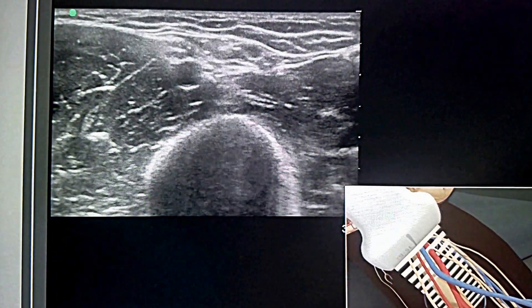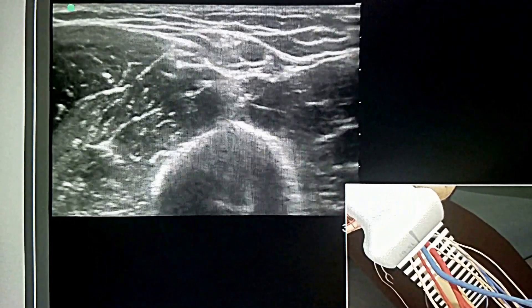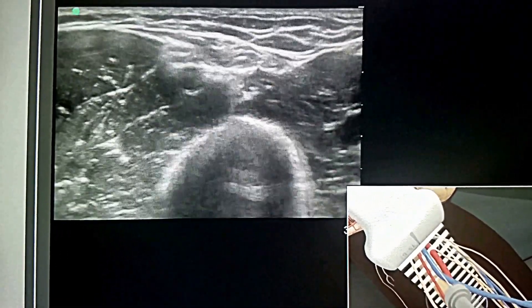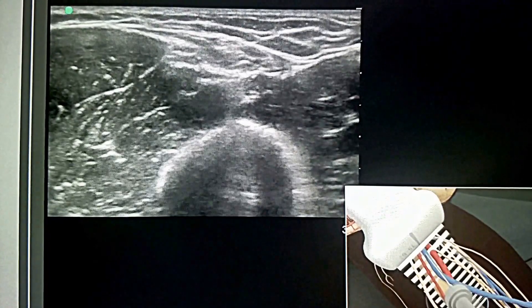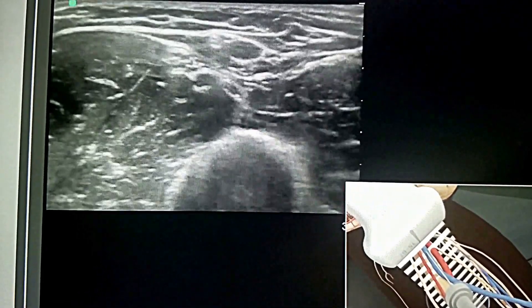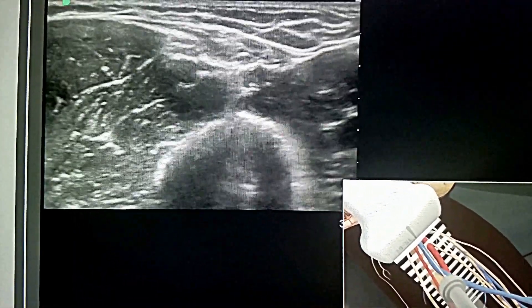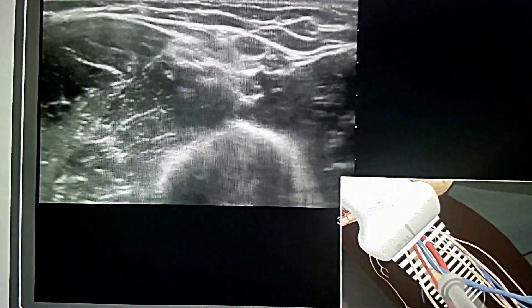Adjust the transducer so it is centered over the basilic vein. Follow the needle entry by slowly sliding the transducer in the direction of needle advancement. The needle will appear as a small bright dot. When the needle tip appears, the transducer should be advanced a short distance to follow the tip of the needle trajectory and stay in advance of the needle entry.